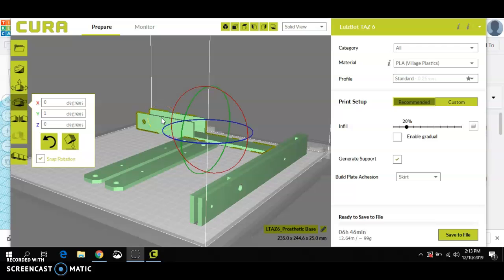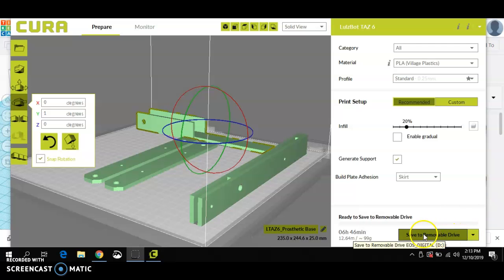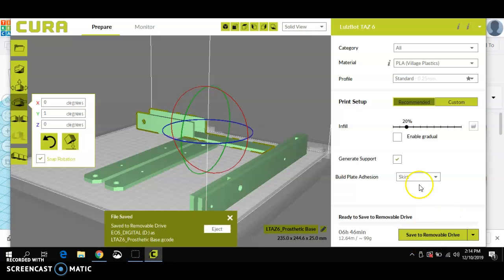Okay, so the final step here, you're going to see when I insert the SD card from the printer, this save to file, I'm just going to close this, save to removable drive. So it's recognizing the SD card. I just click save. Tells me I'm ready to eject and bring that over to the printer.